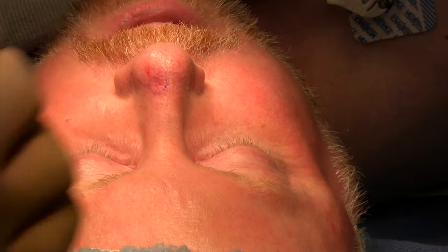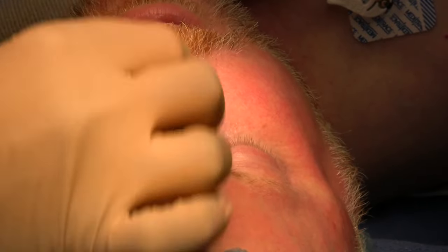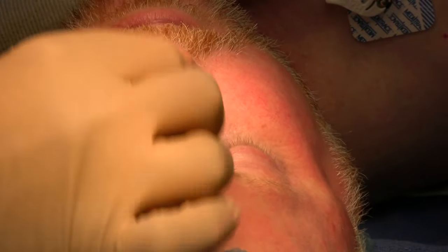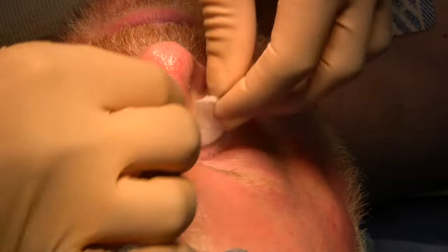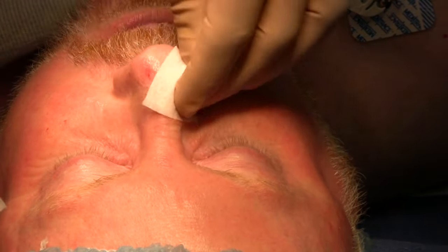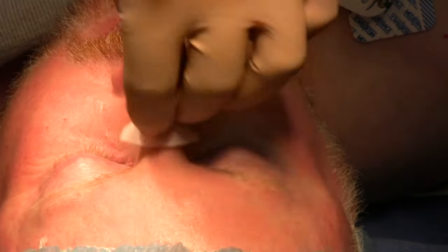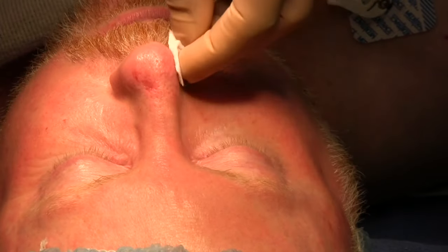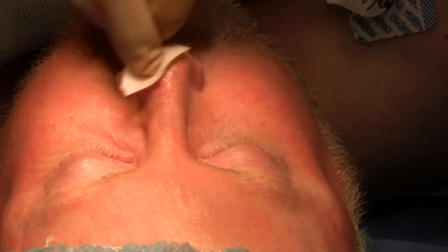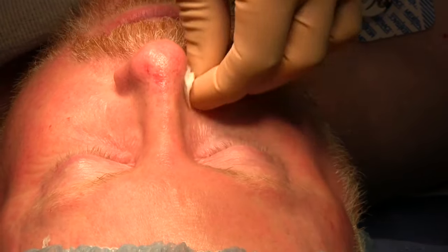How deep do you anticipate the carcinoma going in? Not very deep at all — just the skin itself, not even the fat underneath. When you are dissecting, you go a little deeper than you think you would need to go, and that's where you can ensure that you will get negative margins underneath. We will confirm it with the pathologist. Once we send it out to them, within 20 minutes to half an hour, they will get back to us.